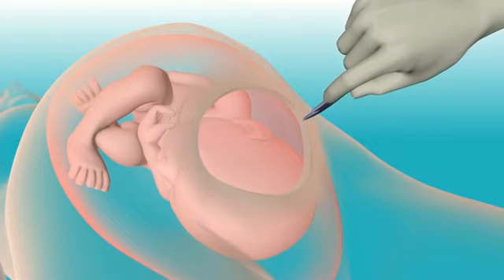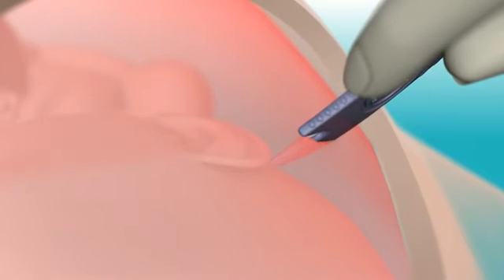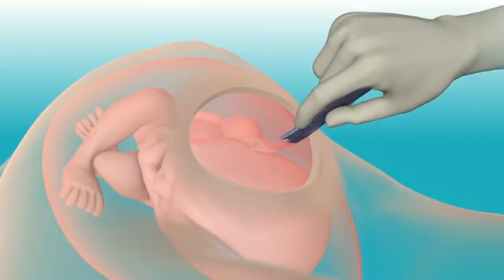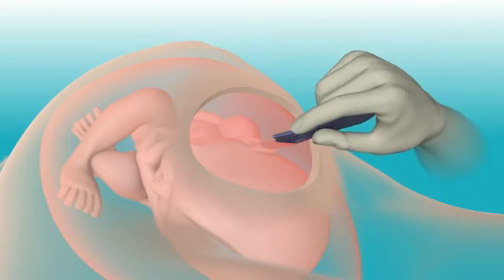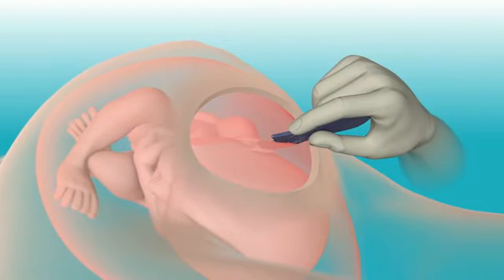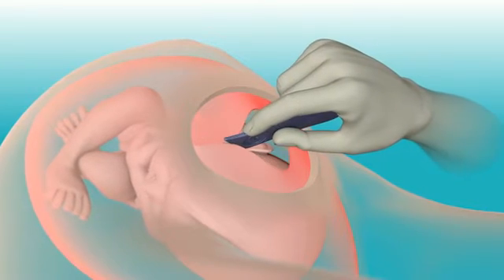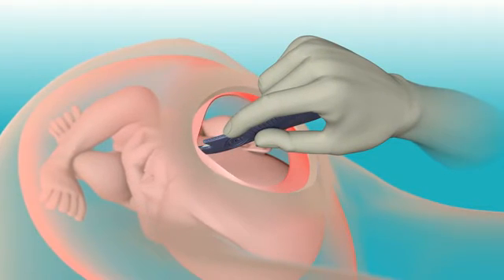If the uterine wall is thin, the tip will easily puncture through it. Once the tip punctures the uterus, by rocking the wrist back, the tip and blade move up and away from the baby. With the device in a rocked back position, continue the incision transversely.